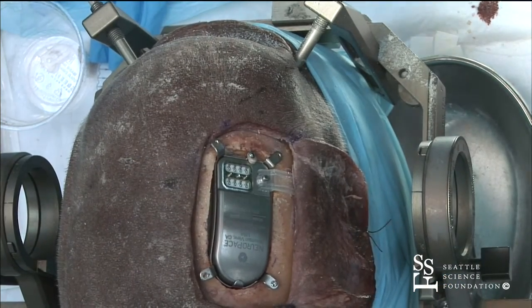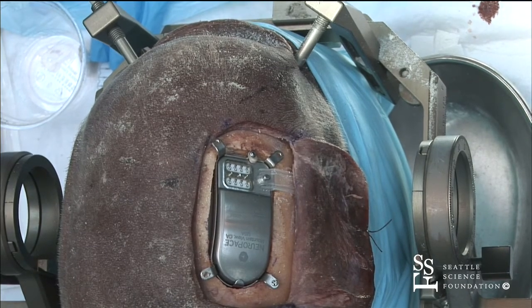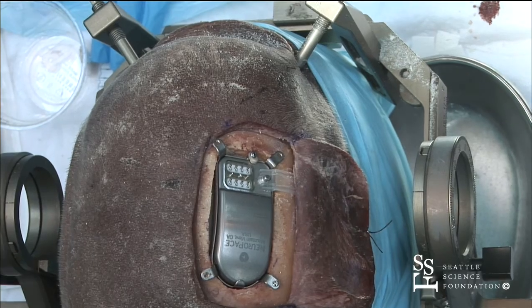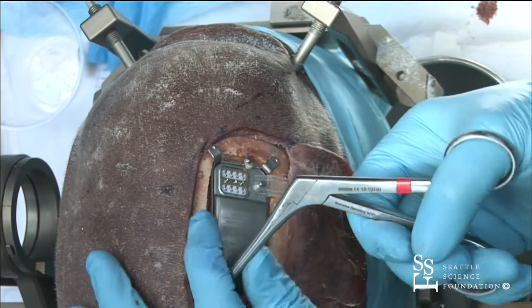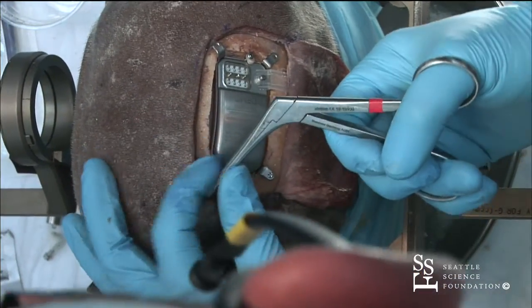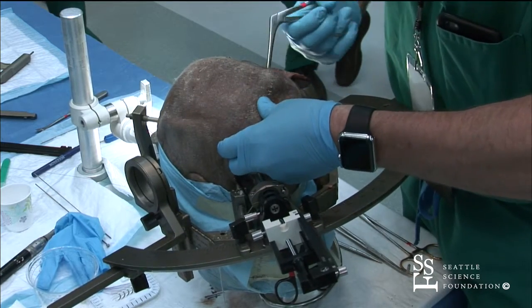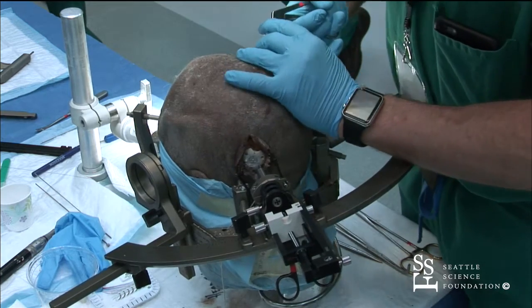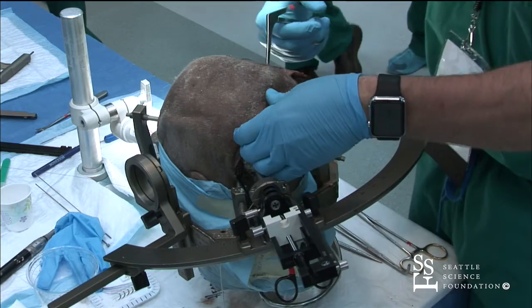I'm going to tunnel with a pituitary. Typically we will have a tunneler. You can use a shunt tunneler, or they have their own tunneler as well. But basically, you just want to get it from one end to the other. Do we have a tonsil or anything, do you know?